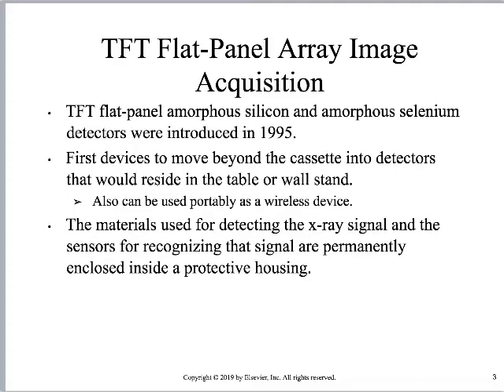What we're going to focus on, rather than all the different types and styles that are out there, is we're just going to break them down into direct or indirect. But the important thing for you to understand is that inside of this detector, there are things that are capable of detecting the X-ray, and they need to be protected themselves. They're very, very fragile systems.